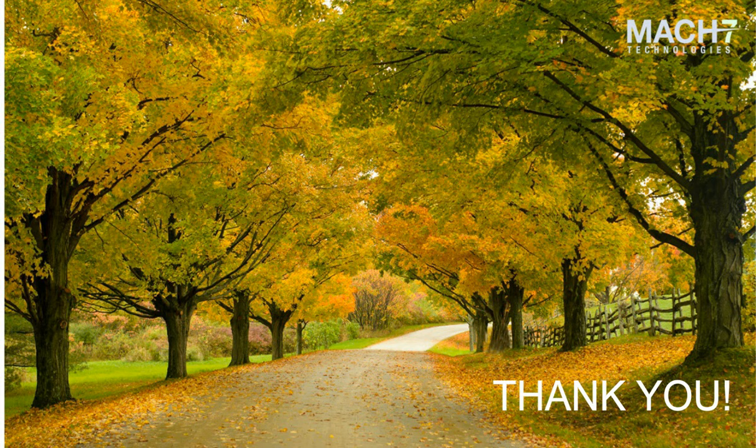And so, because of the way we did it, we put our VNA in front of the PACS viewer, and everything hits that first. So we're able to really manage whether it's slice thickness, the types of images, or if you have something in the DICOM header that you want to use as a keyword, we can manage the correct images that go to our advanced post-processing software specific to men's health.